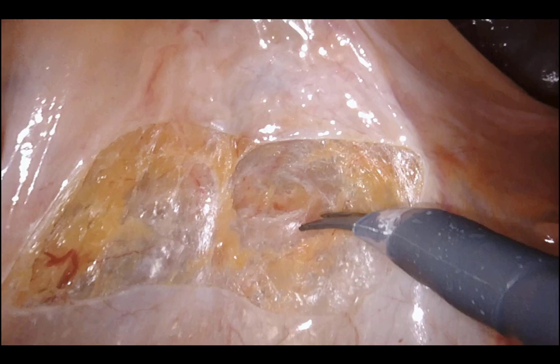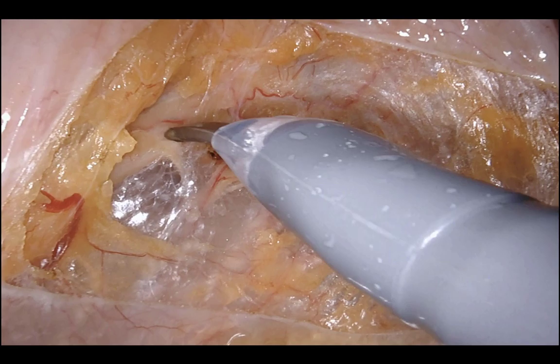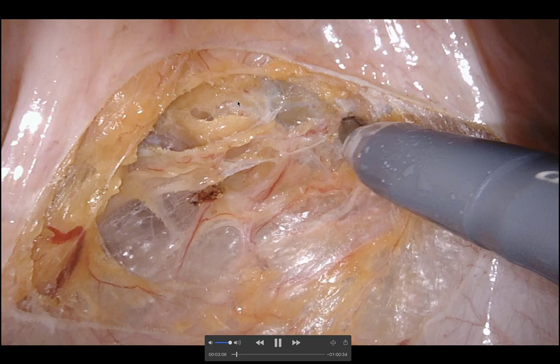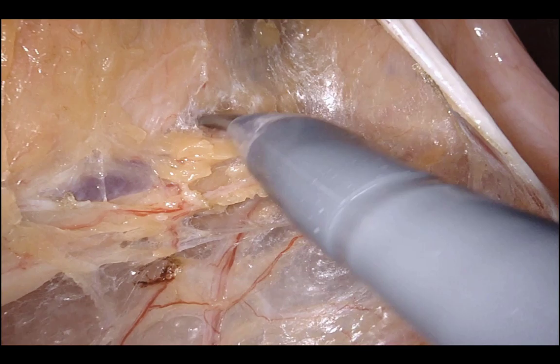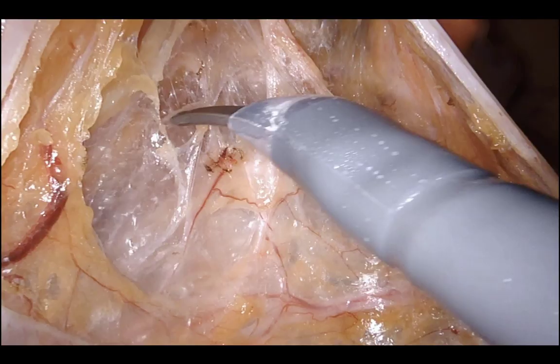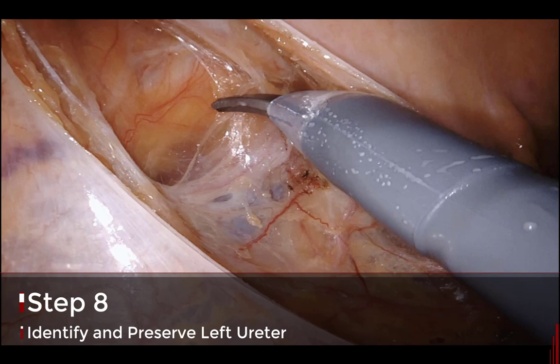That's the start of the medial-lateral section. It's very similar to a lower anterior resection dissection except for the full meso-rectal dissection and diverting ileostomy. The immediate thing I do when I start medial-lateral is identify the hypogastric nerves and preserve them by pushing them down. Third arm hasn't moved; second arm is lifting the meso-rectum anteriorly. Then I poke my left hand in, spread, and lift — you'll see this 'poke, spread, and lift' maneuver constantly throughout my operative videos. It prevents aggressive lifting that could rip or shred the mesentery.